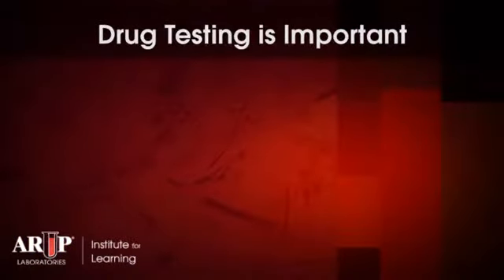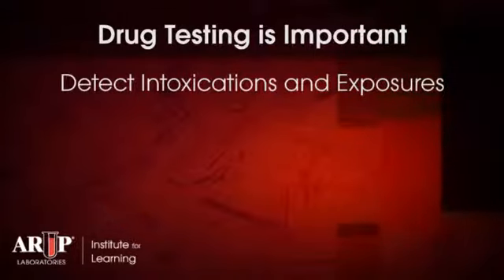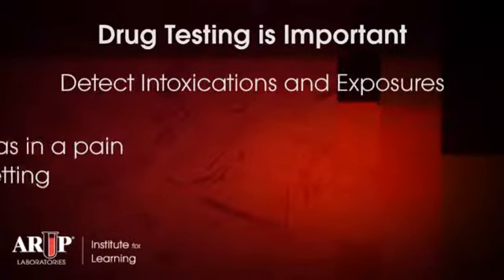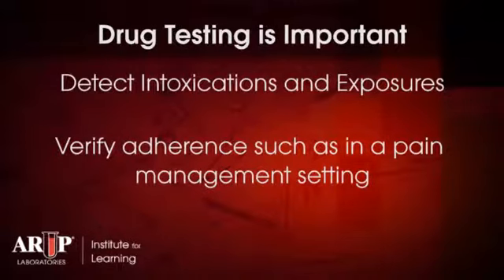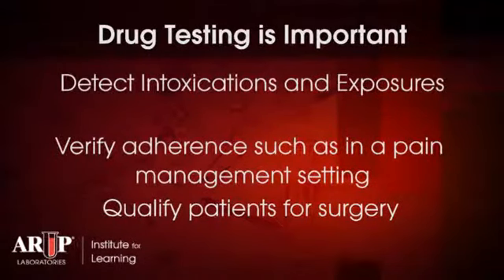Drug testing is an important tool in many medical settings, such as characterizing an acute intoxication in the emergency department, for chronic management of therapeutic drugs, to verify adherence in a pain management setting, as well as to qualify patients for surgery. Medical drug testing is not well standardized.